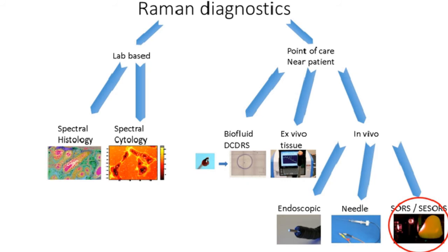Okay, let me finish off with a quick canter through the most non-invasive approach of using Raman spectroscopy. Ideally, if we can not insert anything into anybody, we can have a very amenable treatment that most of us would be very happy to have. Sorry, treatment diagnosis most of us would be happy to have applied to us.